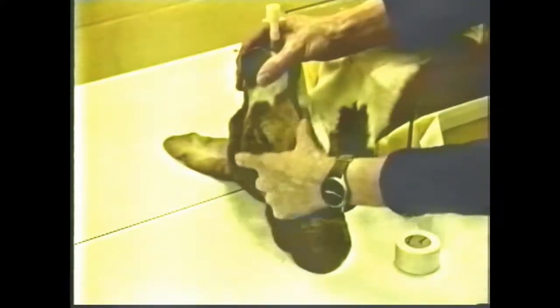This special view of the calvarium is to allow visualization of the symmetrical frontal sinuses without any superimposed structures. After this film is made, it is so specialized that other areas of the film should usually be ignored and not interpreted for any other reason because of the distortion. You'll notice that the nose is taped to the frame, and the nose is basically pointing at the X-ray tube. The measurement is made from the medial canthus of the eye to the back of the skull to establish the technique.